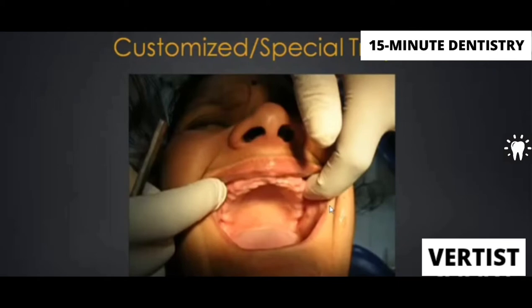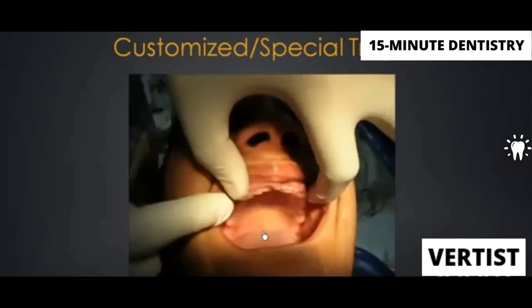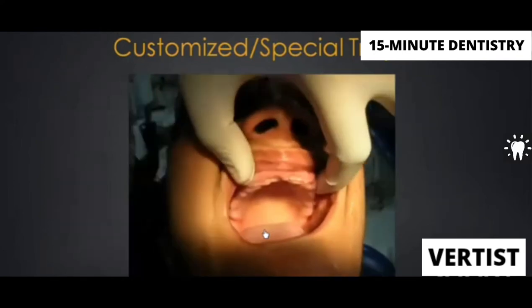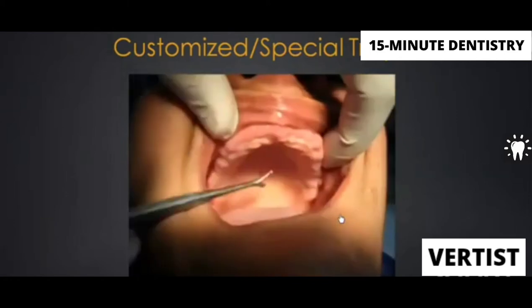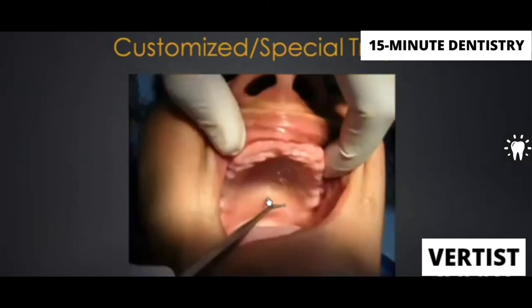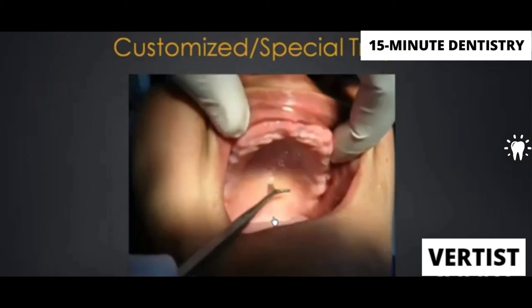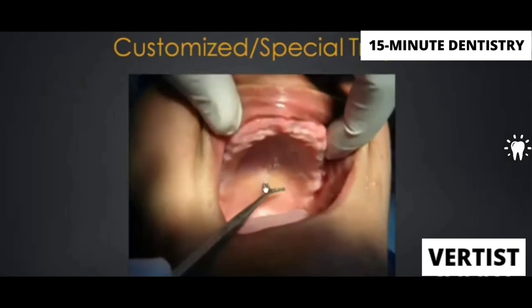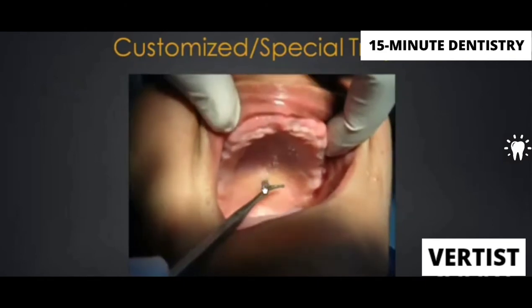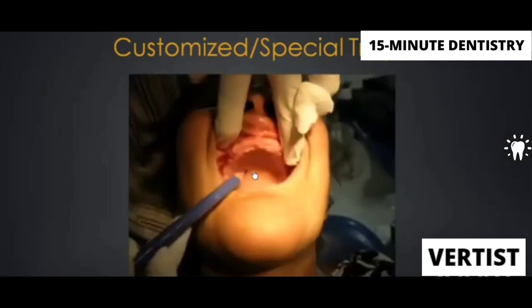Okay, I hope you can see this in the video. Yes, again, we are asking the patient to say ah, and you will see the palate going up. You will see some shadow over here. I'll just point out where the posterior vibrating line is. This is going up, see, and it starts going up from the point over here. So this is where our posterior vibrating line lies.